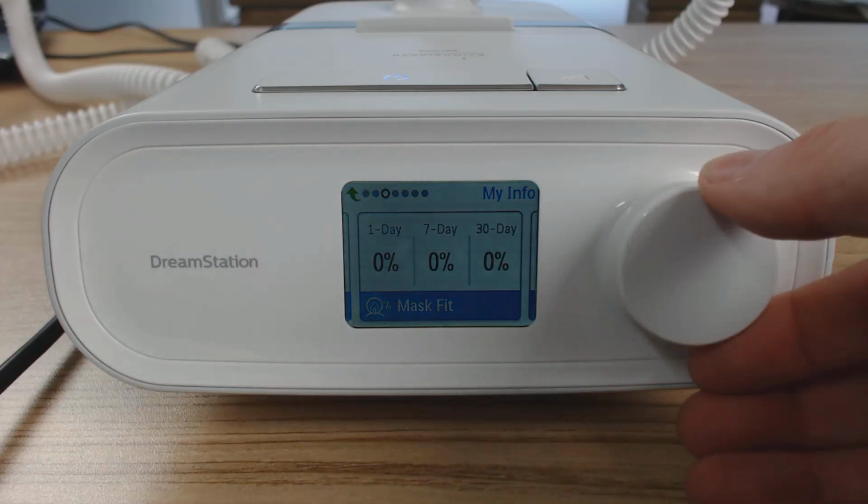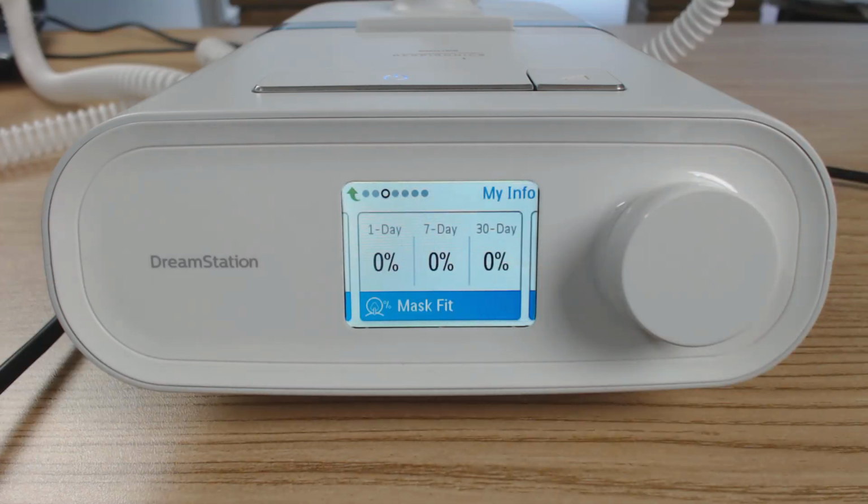And if your number is getting quite low, you might need to work on getting a new mask, maybe a new seal, some new head straps, or just working on your general fitting of the mask itself. So try and get that up as high as possible towards 100%. If you're getting 100%, you're killing it.